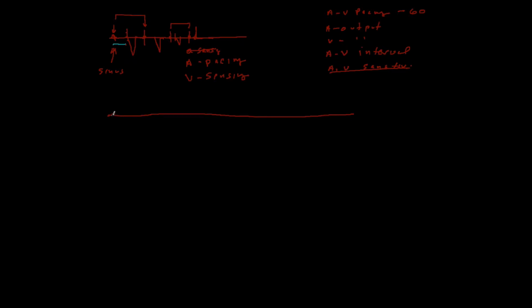What you don't want to have is, let's say you unplug your pacers temporarily and you see that you've got decent AV conduction, normal atrial and ventricular activity, and this is, say, at a rate of 55, then you don't really want to have your pacing going at 60, because you're going to get some native slowing and speeding up, and you're just going to have the pacemaker and the patient compete with one another.